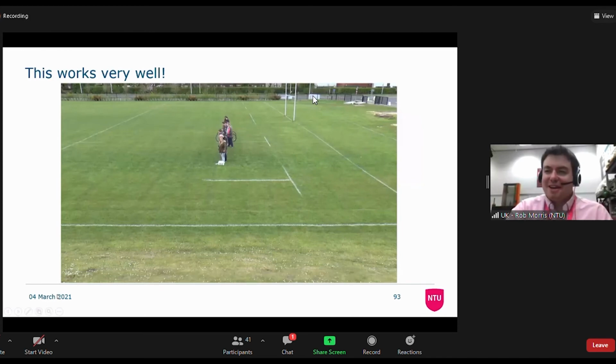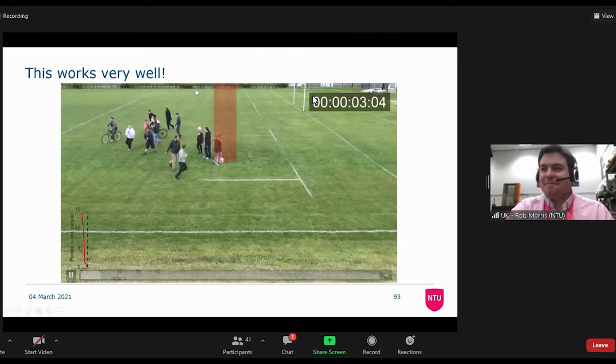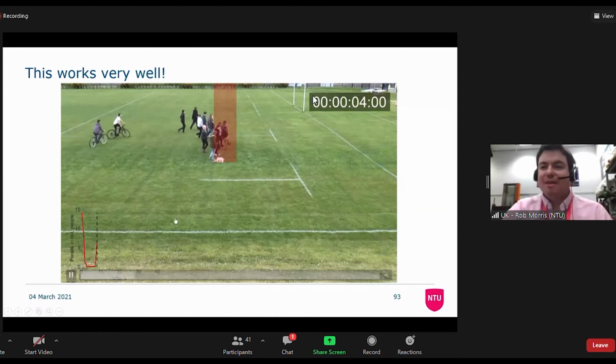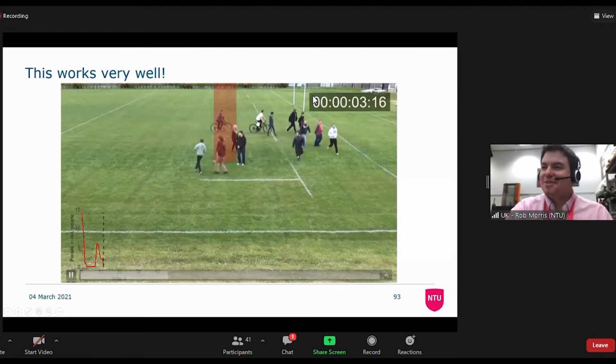We some years ago did this with people, which was really good fun, and we had some people on bikes and they ran around on their bikes, and some people walked. And actually, if you count the number of people in the red box as they come backwards and forwards, this does work really well. We also captured an interesting first echo, which is diffusion weighted just like in real life, which I thought was really neat.